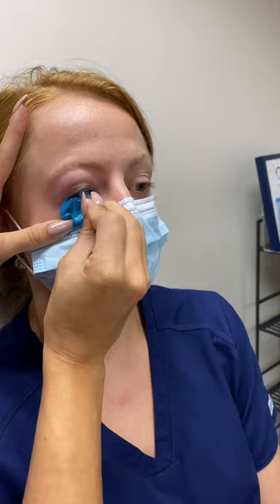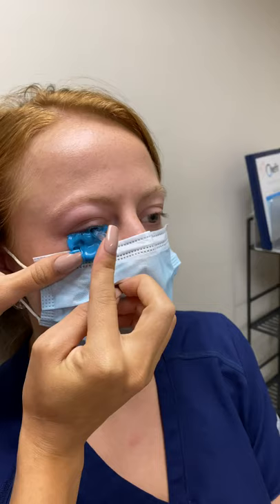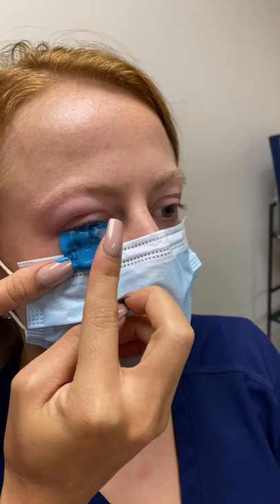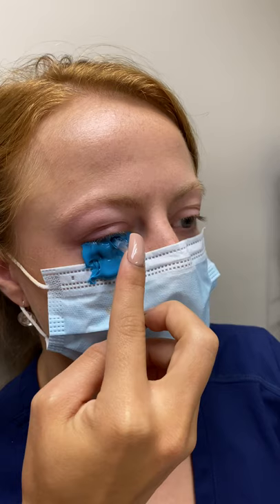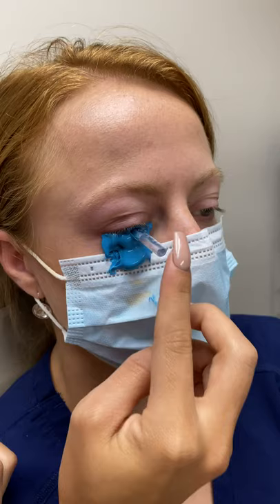We're doing an eye print probe and our student extern Noelle. The idea is to do an impression of the front surface of her eye, and the impression material is sent to a special lab where every detail and every aspect of the ocular surface is replicated onto the back surface of an EyePrint Pro scleral lens.